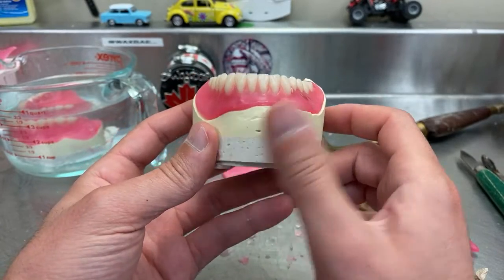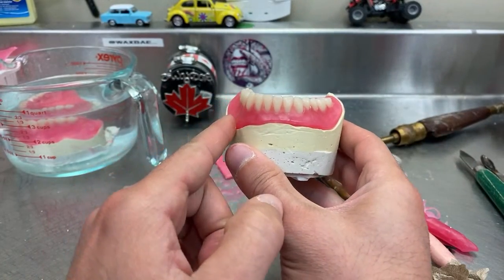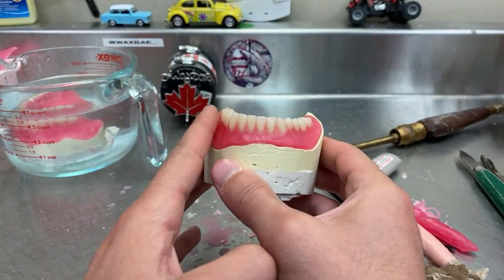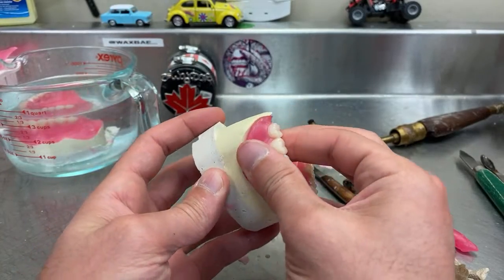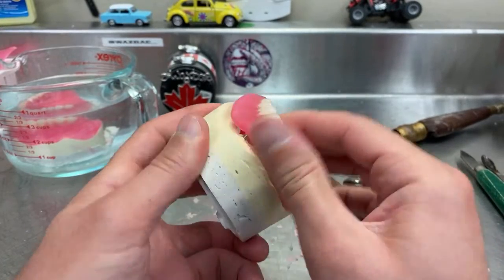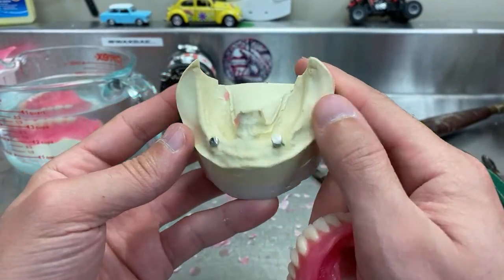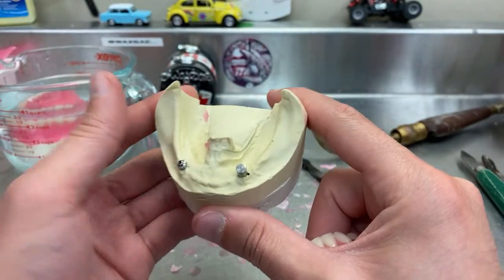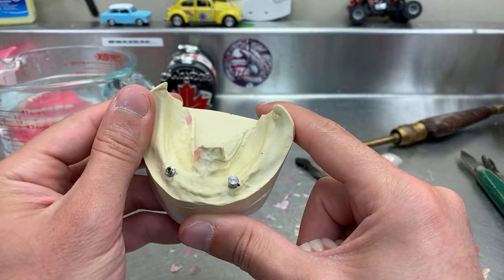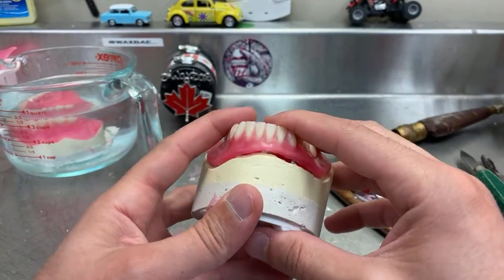So yeah, it helps, because if you had it just a straight line or like this, I see a lot of students do it, which is not even students actually, even lab technicians that they're working, they do it a straight line here. And I'll be honest, not always you'll have enough space to do it, but if you do, please do it. Here's the thing that I'll show you. You see how that shelf here, it's big enough, it's nice, it's wide. Some cases you will not have it like that. The patient will not have that much space here. Naturally it will be to here, so you will not be able to do that. I hope it was clear.